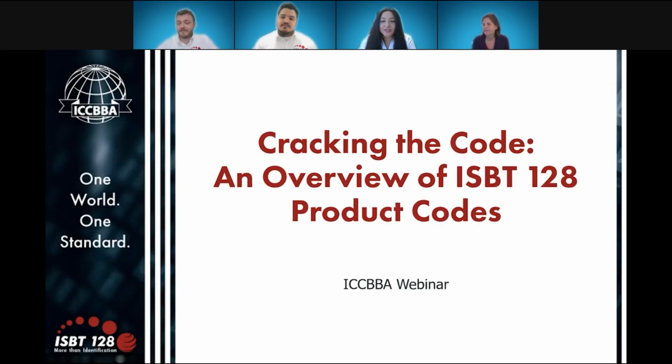Thank you. I have a question for Ryan now. How are product description code values assigned to the MPHO types? Yeah, so when we receive a request, blood, cell therapy, and so on, we already have pre-assigned groups. Like I explained earlier, for blood products we would give them the MPHO identifier E, for cell therapy S, and tissues T. These are already assigned, and that table can be found within our standard technical specification document, section 2.4.3.